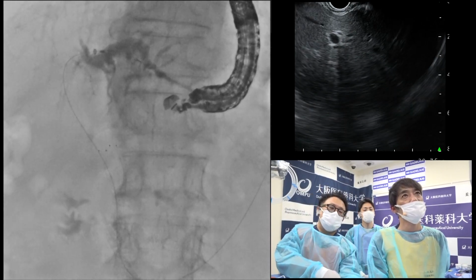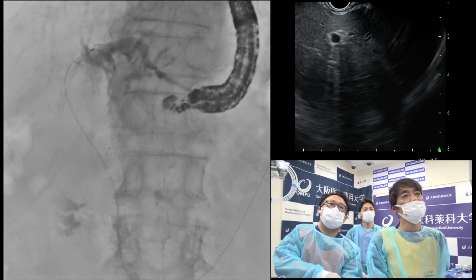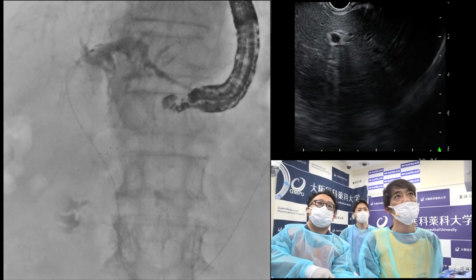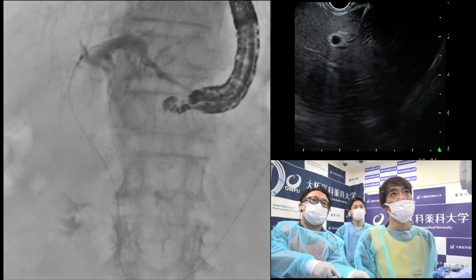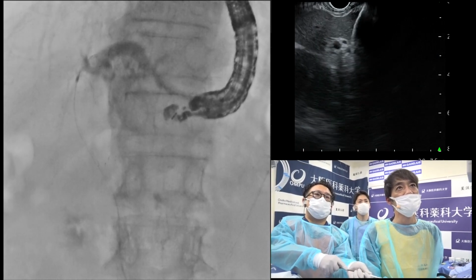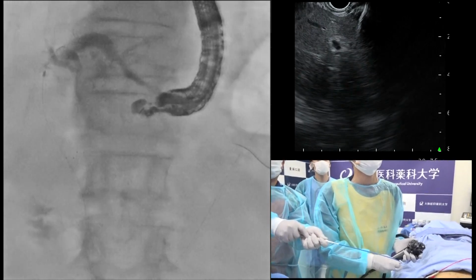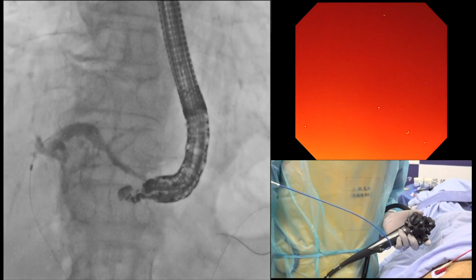Okay, please go. Okay, the distal side is very appropriate here. Okay, go. And then continuously stent release is performed up to 4 or 5 cm in the echo endoscope. Go. Right around here. Okay. And then we switch the endoscopy view.